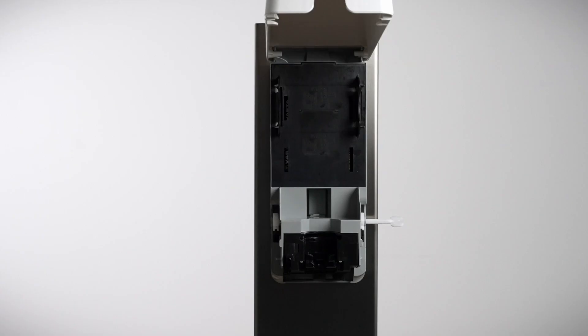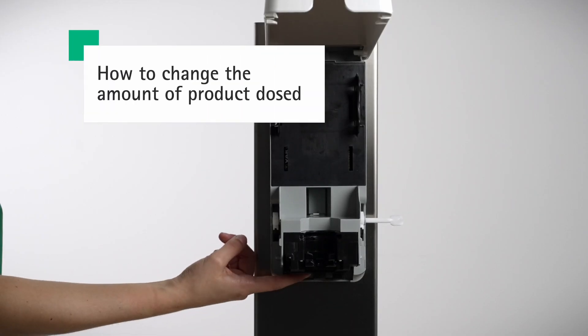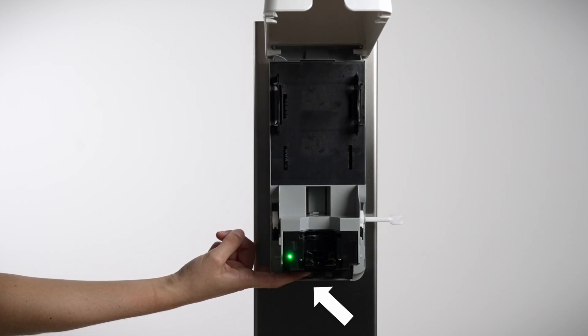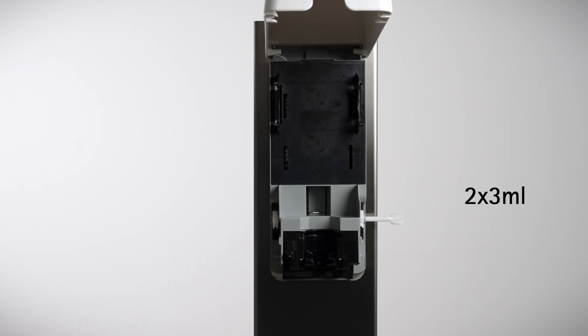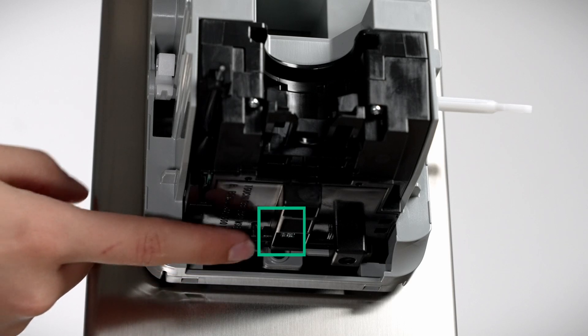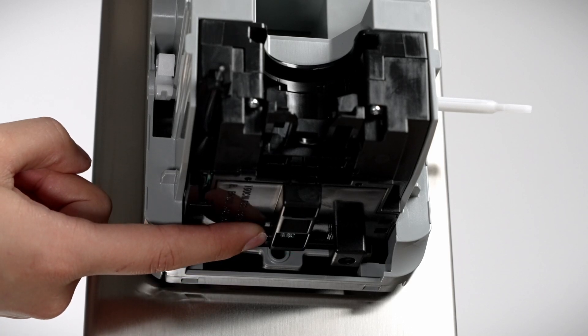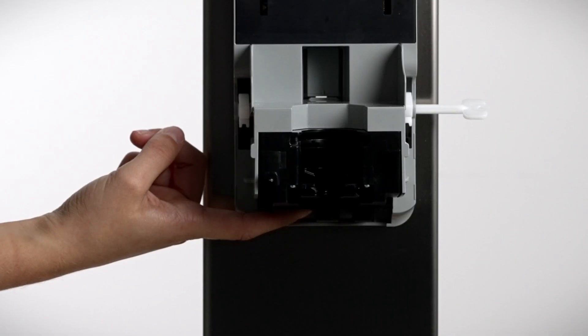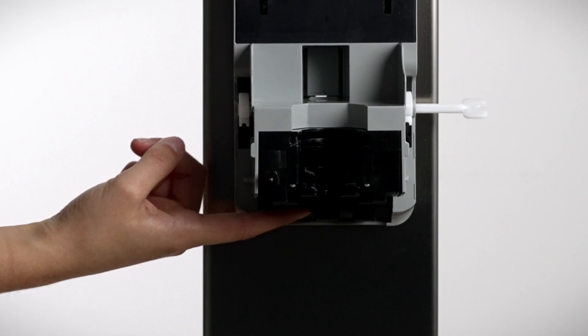Reinsert the refilled case. The standard configuration of the dosing amount is 1.5 milliliters per dose. If you need to adjust the dosing amount, you can change it to 0.6 milliliters, 3 milliliters, or 3 milliliters two times. There are four different dosing functions. When you press the small button underneath the dispenser while the cover is open, the LED indicator signals appear: one flash is 0.6 milliliters, two flashes are 1.5 milliliters, three flashes are 3 milliliters, and four flashes are 3 milliliters two times.